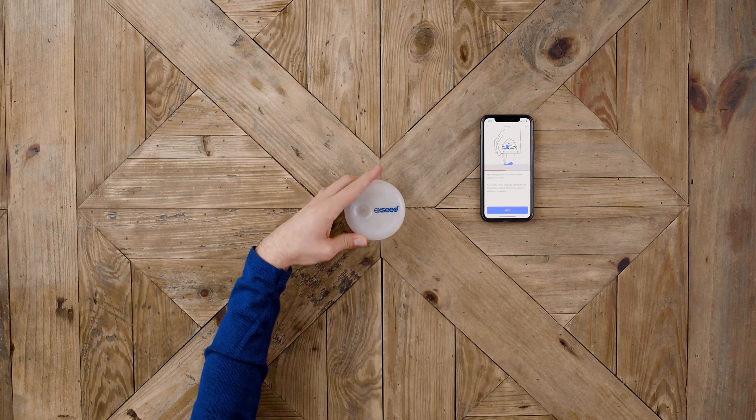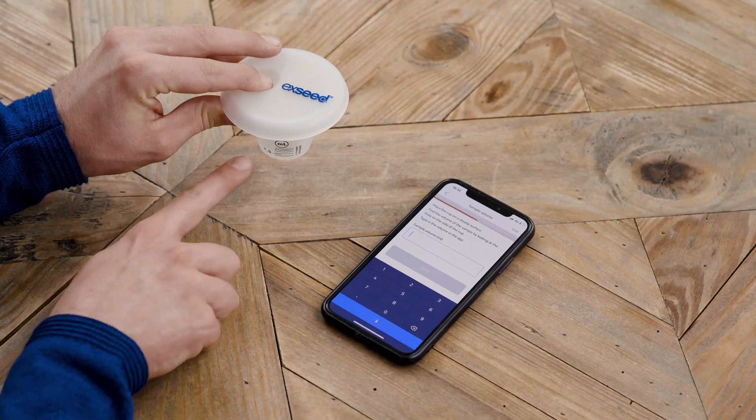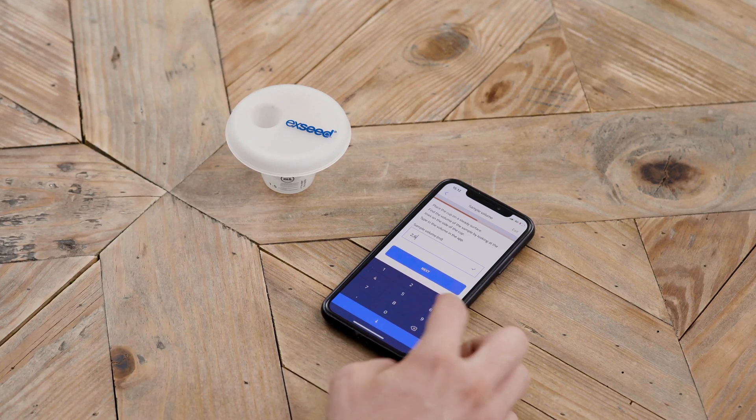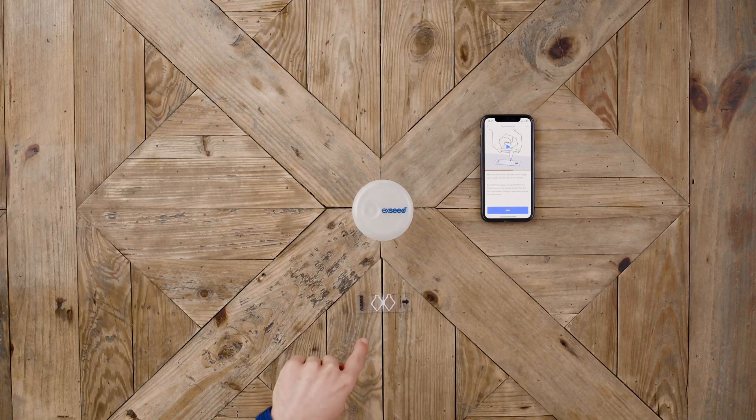Mix the sample by rotating the lid five times without lifting it. This way the pipette is used to mix the sample. Find your sample volume by using the scale on the cup, then type in your sample volume.